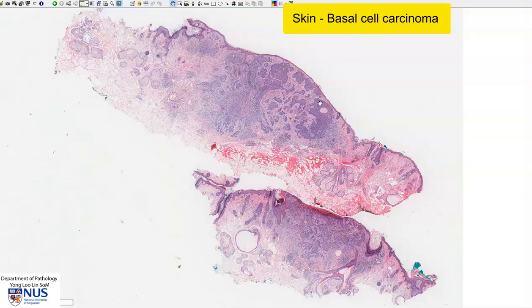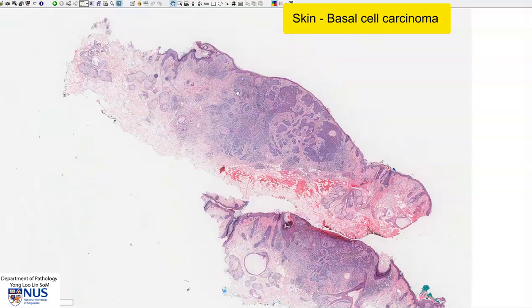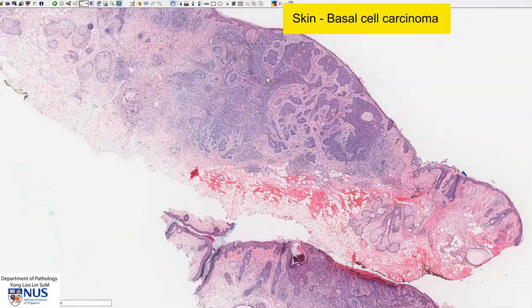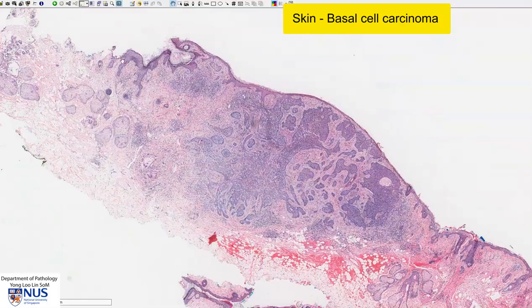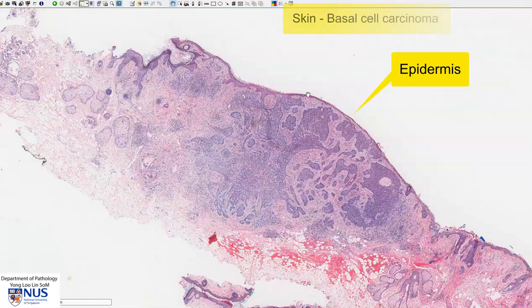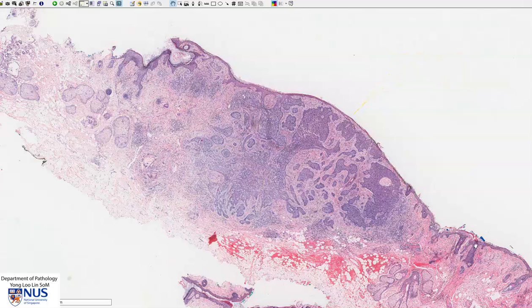Let's focus on this piece. Just to orientate ourselves, this is the surface of the skin and this layer is the epidermis. I'm going to trace the epidermis all the way here to the edges where it's pretty much normal.